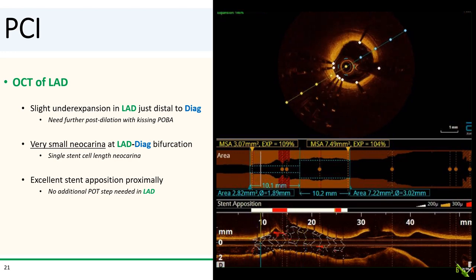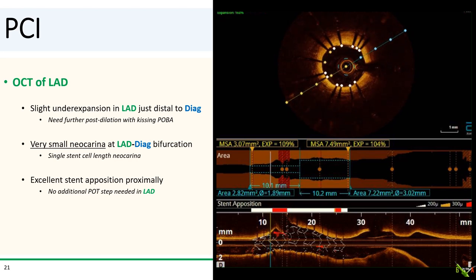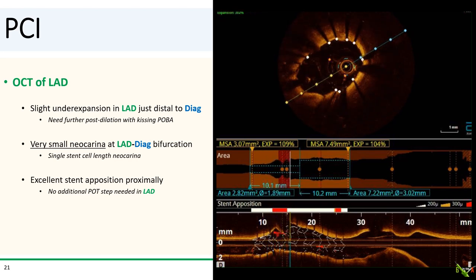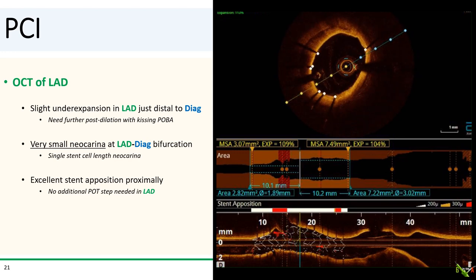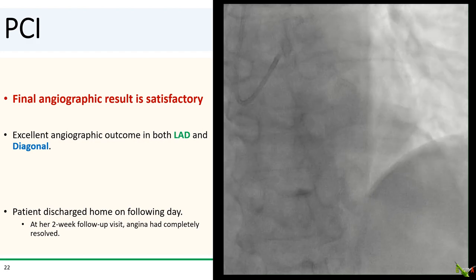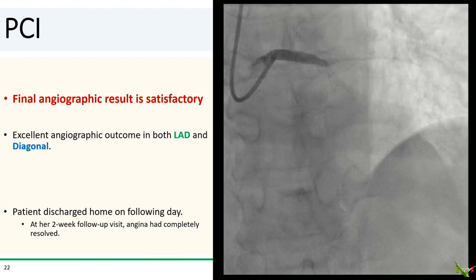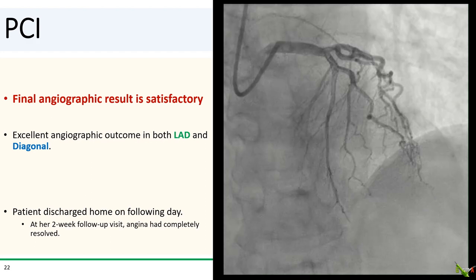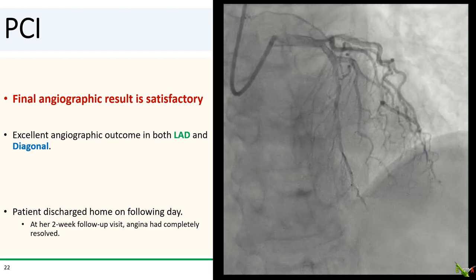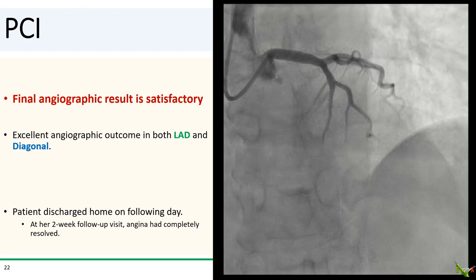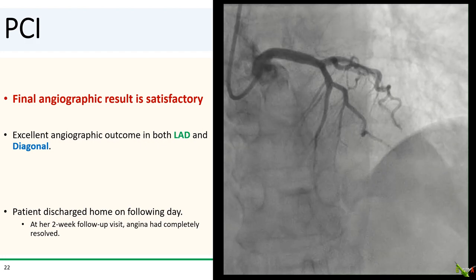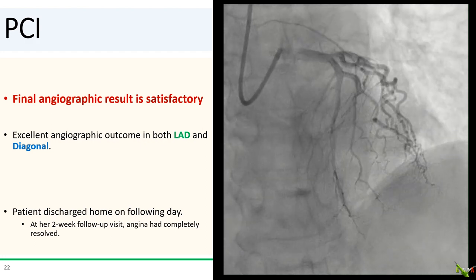Proximally, the stent looked great with excellent apposition and sizing, so no additional POT step was necessary. After another round of kissing balloon angioplasty, here is the final angiographic result, which we thought was very nice — there was excellent angiographic outcome in both the LAD and diagonal. The patient went home the next day, and at her two-week clinic follow-up, she looked great and her angina was completely gone.